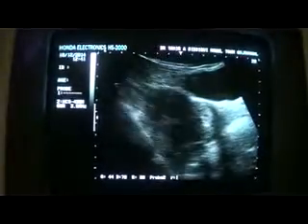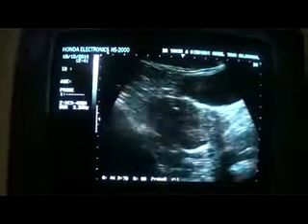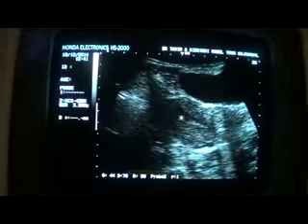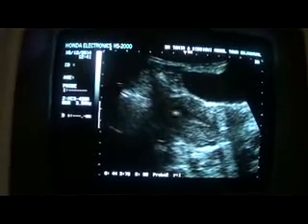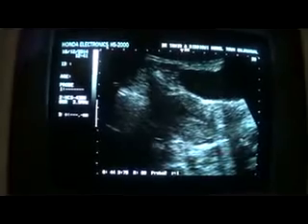A bit I'm magnifying it to get the full view of the uterus and then to align it with the vagina. This is the full view of the uterus, and this is the anterior myometrium, posterior myometrium. This is the endometrial canal appearing central and clear. This is the urinary bladder, and this is the longitudinal section.